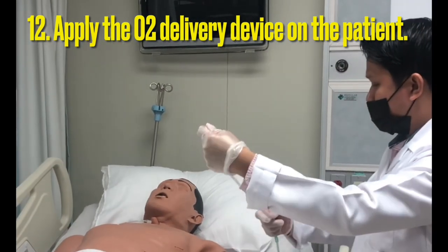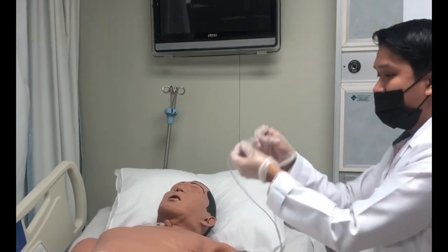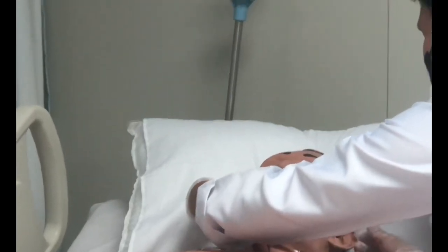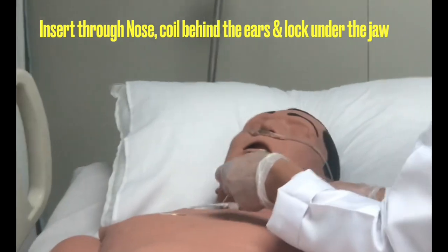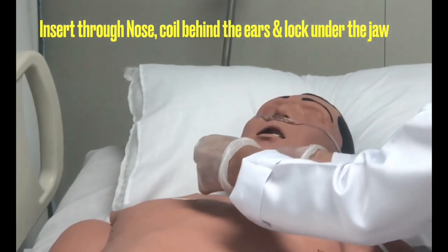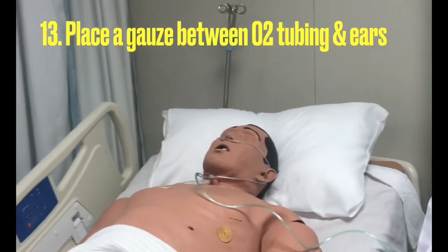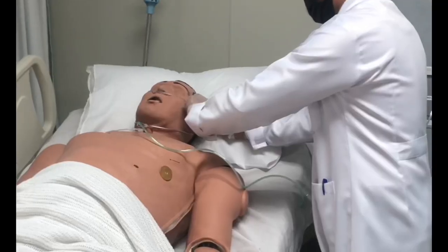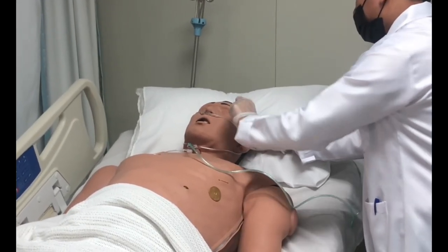'Mr. Muhammad, I'm going to attach now this oxygen cannula right through your nose.' Attach it first to the nose, then coil the tubing up and over the ears, and lock it under the jaw or chin of the patient. The next step is to put gauze between the tubing and the ears.